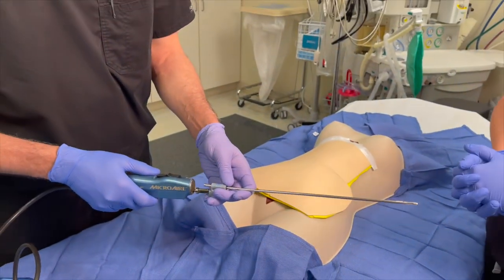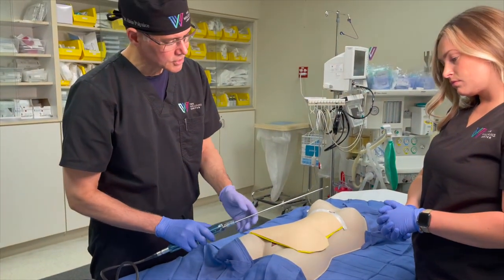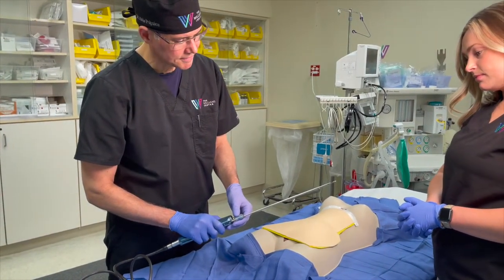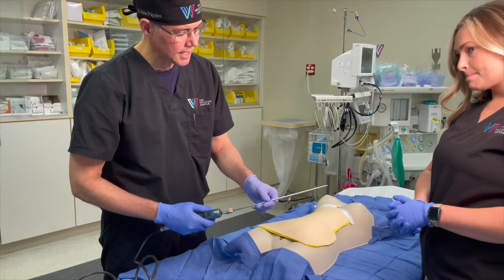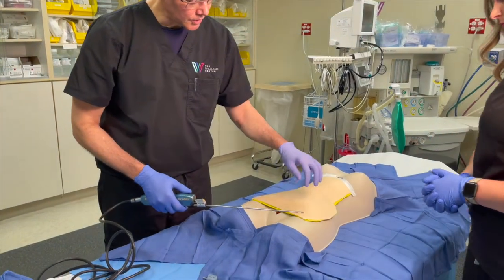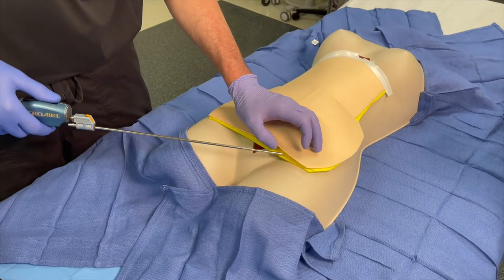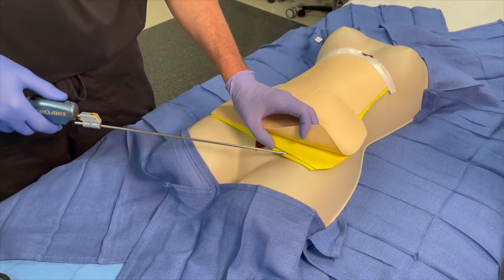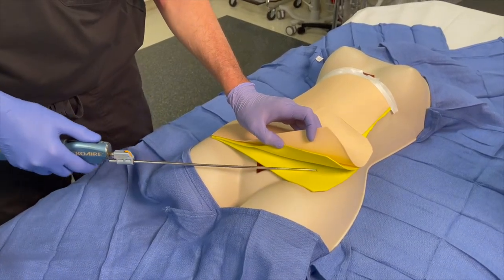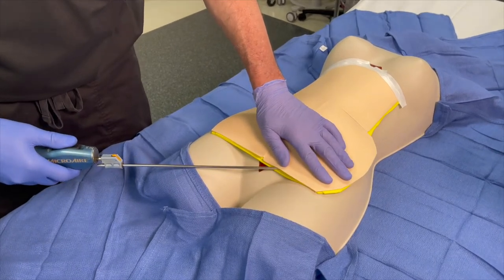The cannulas are placed on this hand device, and it's called power-assisted lipo because when you turn it on, it vibrates back and forth, which allows us to do the liposuction a little easier. For the lipo, we make a small incision through the skin, the cannula goes through that incision, and it goes typically under the superficial layer of fat, right above the deep layer, and the liposuction is done right there. We're going back and forth in that layer.